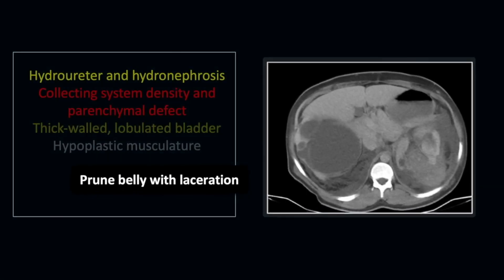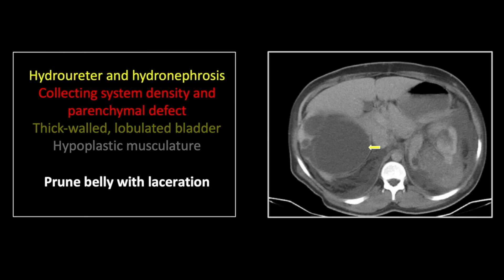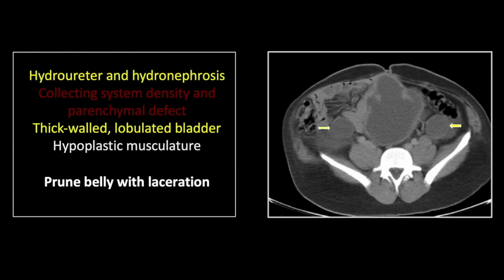Our next case is a case of prune belly with dilated, obstructed kidneys and an associated laceration. The uninjured right kidney has a markedly dilated collecting system and just a bare wisp of remaining atrophied surrounding renal parenchyma consistent with long-standing obstruction. In the left kidney, there are similar but less pronounced changes with a dilated collecting system and atrophied parenchyma, but also a through-and-through defect of that atrophied left renal parenchyma with hyperdensity consistent with hemorrhage and clot. Farther down, you can appreciate marked dilation of both ureters and a distended, lobulated, and irregularly thickened bladder. Note also the near-complete absence of anterior abdominal wall musculature, essentially diagnostic of prune belly syndrome.